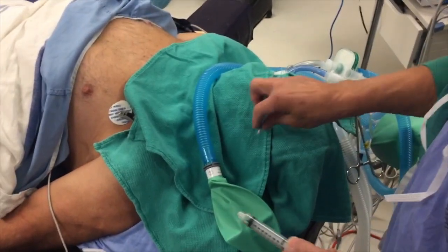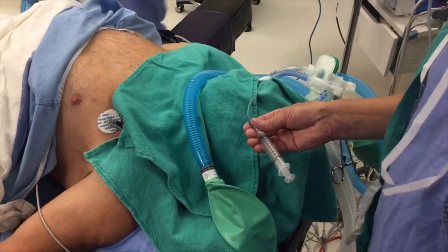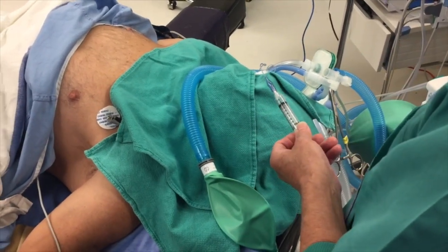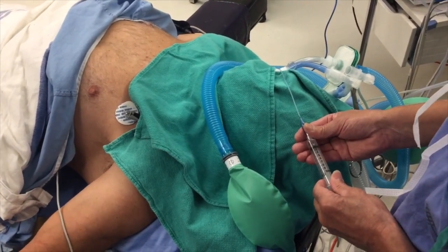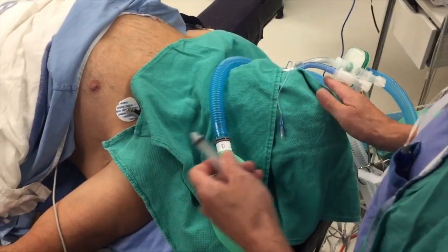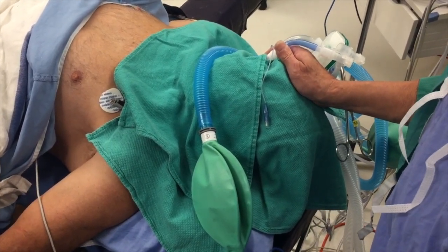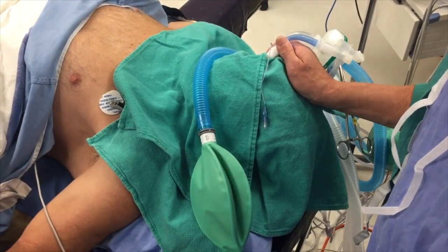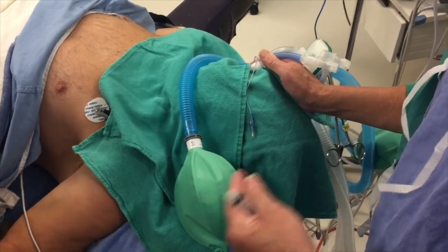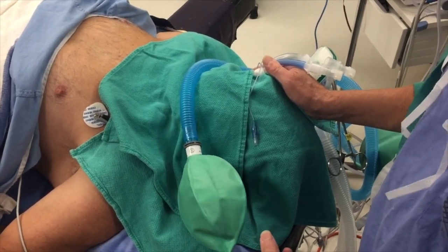Now I'm going to show how we determine how much air to put into the distal cuff. I'm going to withdraw air slowly — make sure I'm ventilating — and there you see the bag begins to inflate. It stops inflating, so that's the minimum amount of air in that distal cuff. Now I'm going to gradually pull back on the tube until I create a leak again. There — we see air accumulation. So now we can see I just created a herniation in the cuff. This is a very useful monitor when positioning the patient to the lateral decubitus.